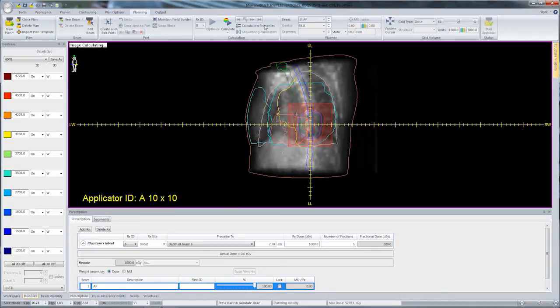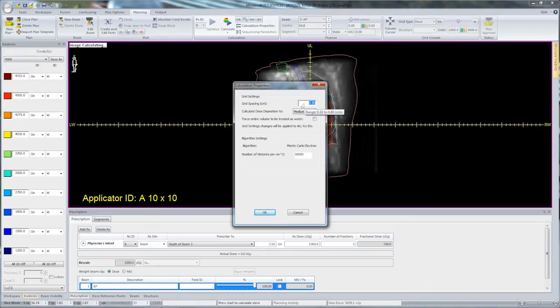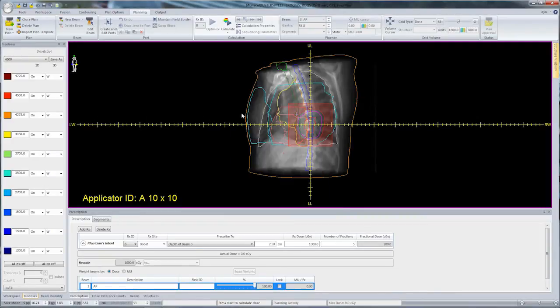We can check the calculation properties from the template and make sure that's what we want for this particular plan. In this case, I'll reduce the grid spacing to 0.3 and have the option to change the number of histories for the Monte Carlo calculation. Having set that correctly, I'll hit the Calculate button and start the dose calculation.